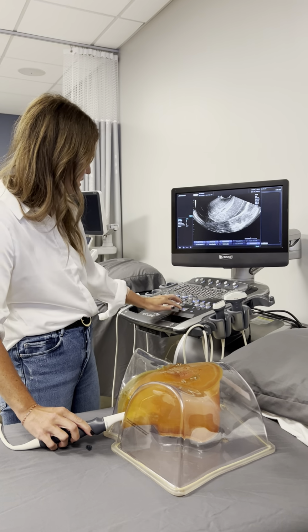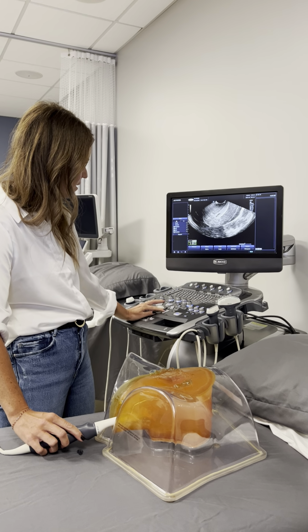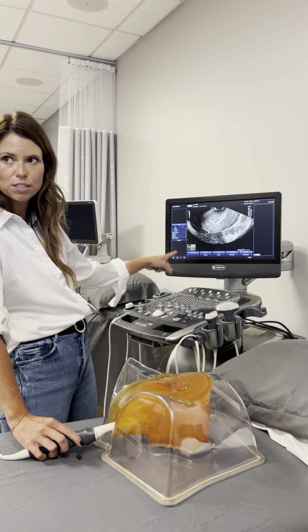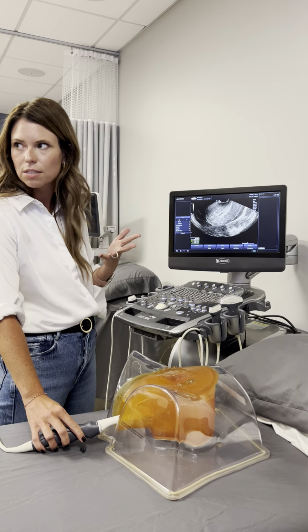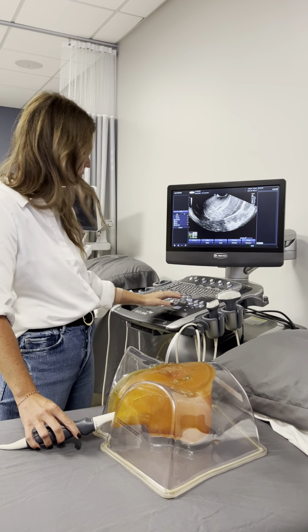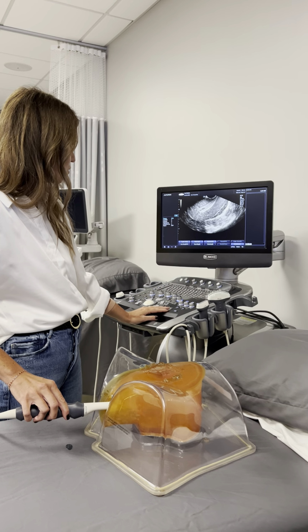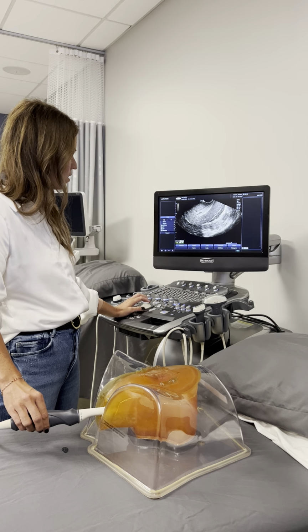So when I'm measuring, I'll measure the endometrium from here to here, because you measure it in an anterior posterior measurement. So hers is 9.4. So she's probably about to ovulate. And then you will measure your uterus. You'll try to get a good view of the fundus all the way to the cervix.